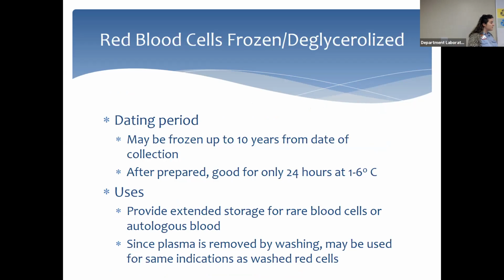Number one, you want to deglycerize it. So you're going to go through a series of washing. You're going to add different dilutions of saline and wash it very well. What happens if you do not wash that glycerized unit of red cells appropriately? What happens if there's glycerol still remaining in that unit? It could potentially be transfused to the recipient, which could cause cell lysis, all right? So then it could be harmful for your recipient. So it's very important when you are thawing a frozen red cell that you have adequate washing, okay?